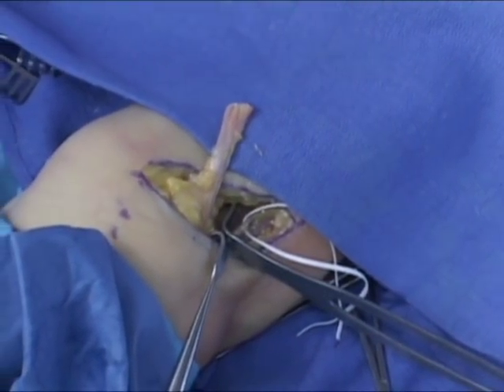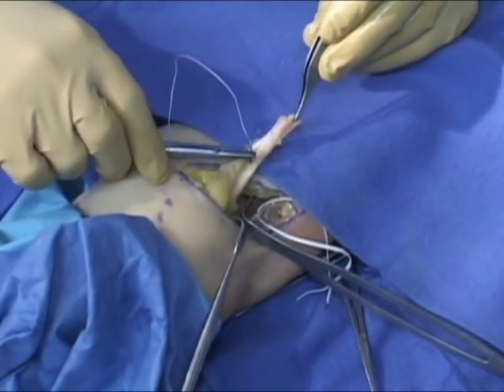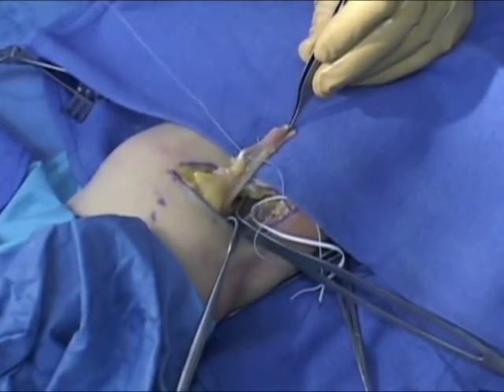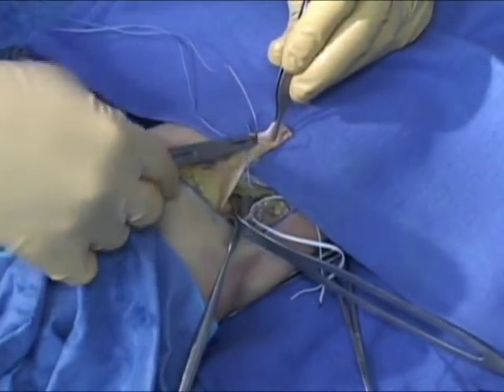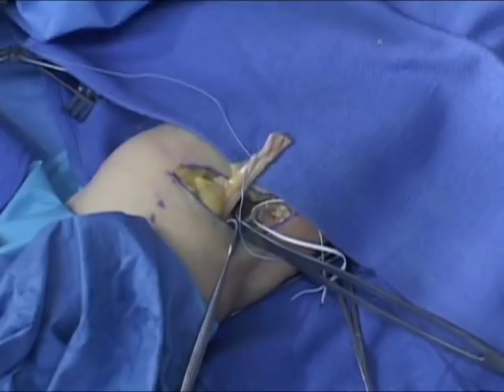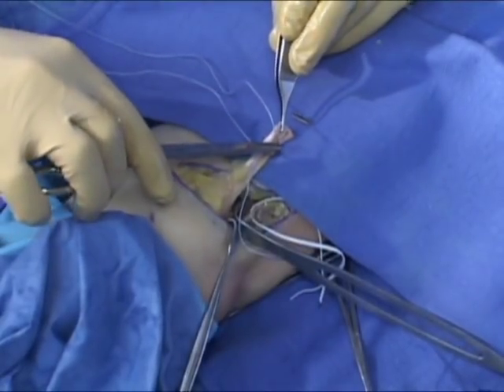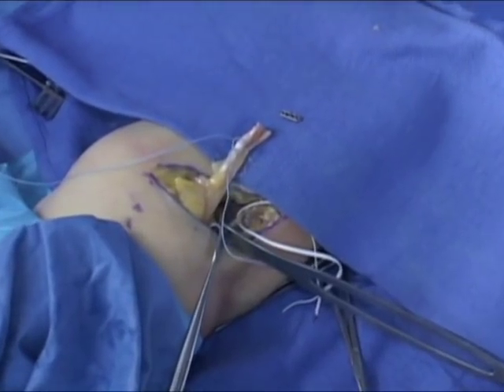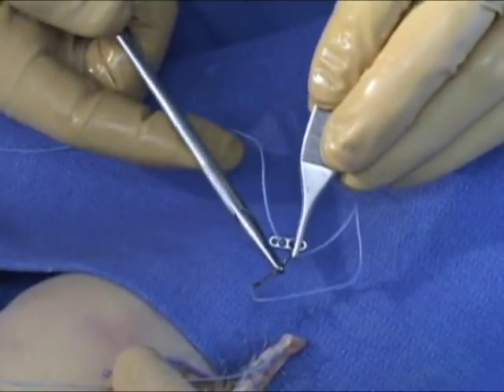A number five fiber wire suture is then placed in a locked baseball or Krackow stitch. Three or more locking loops are created, advancing distally towards the tendon end. A 9 mm endobutton is chosen. The first fiber wire suture is then carefully passed through the medial holes of the endobutton, leaving the lateral holes for the later marionette sutures.